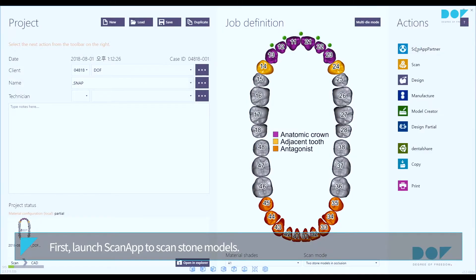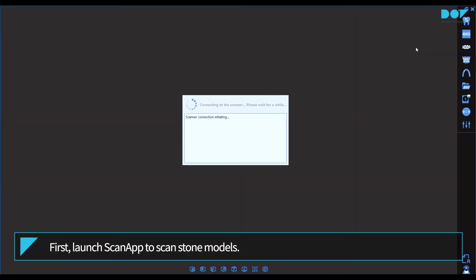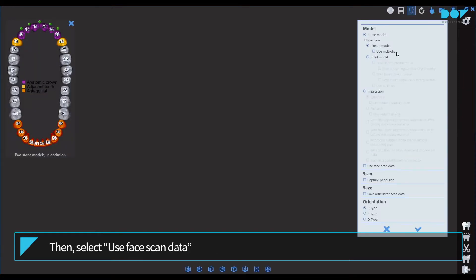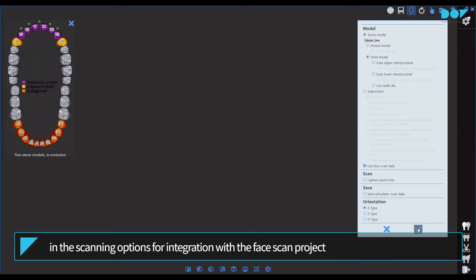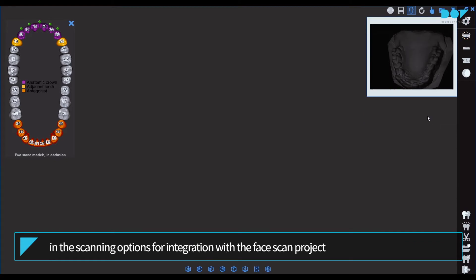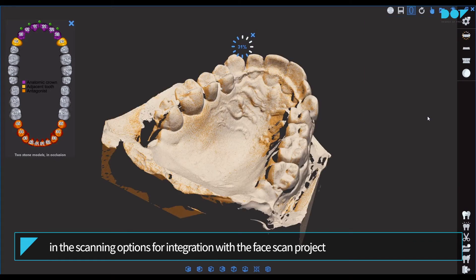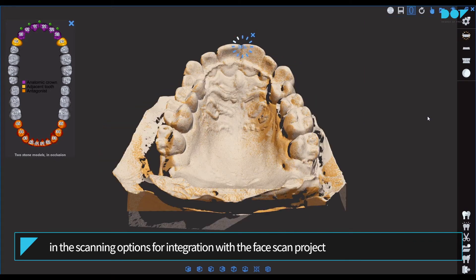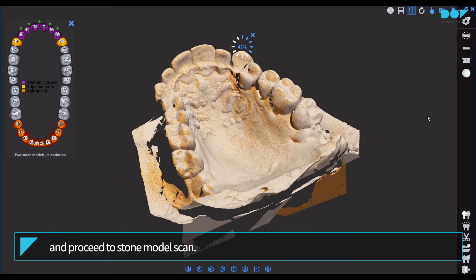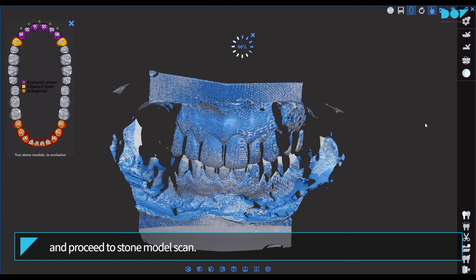First, launch ScanApp to scan the stone models. Then select 'Use Face Scan Data' in the scanning options for integration with the face scan project, and proceed to Stone Model Scan.